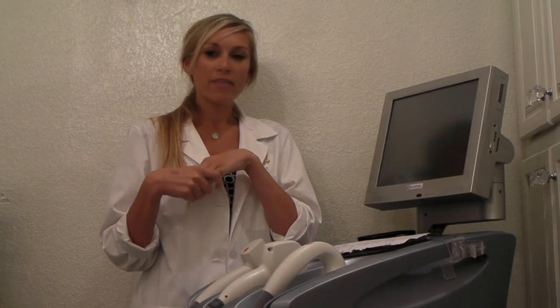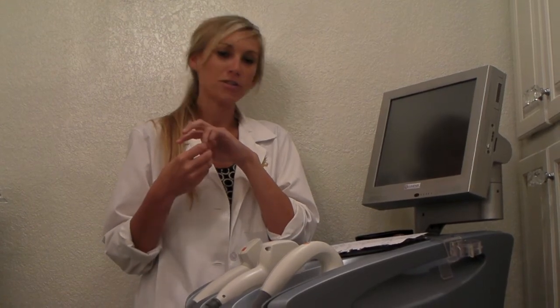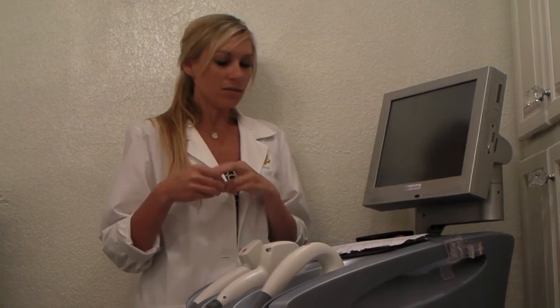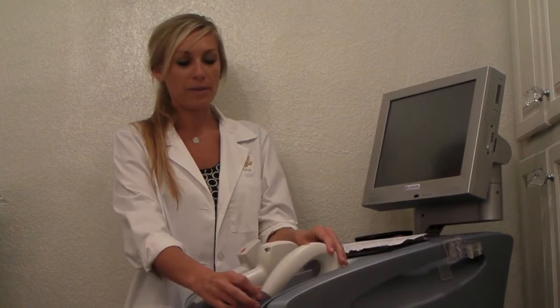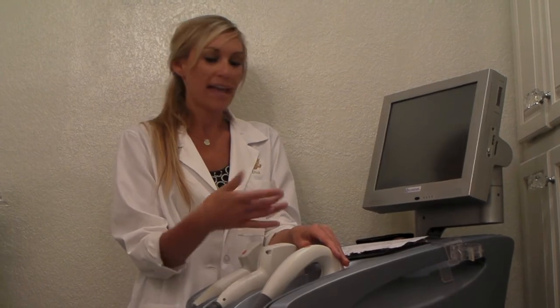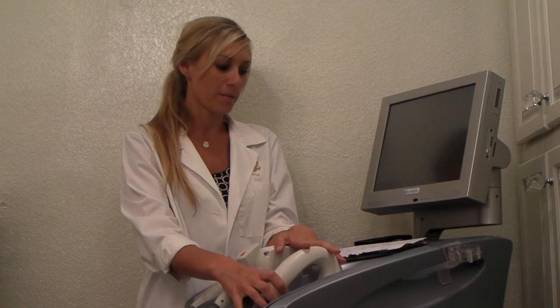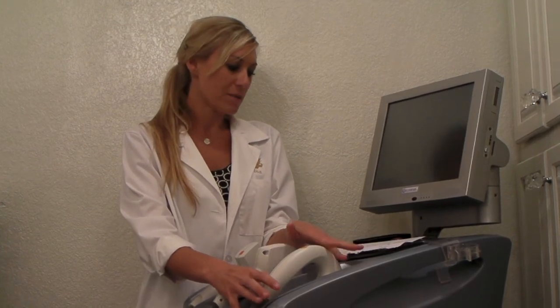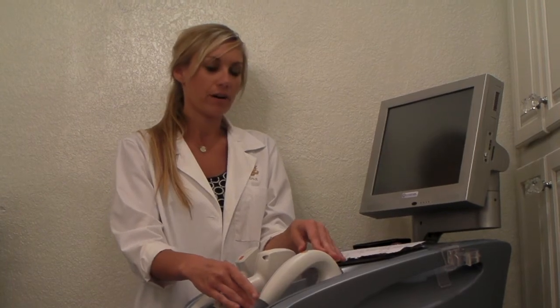Treatments are done monthly for the IPL. It's very important to moisturize during treatment, and again, sunscreen. Any of the skin lesions that you're thinking about having treated with the IPL, you should assess yourself. The ABCD rule is very important whether you're having the laser therapy or not. Watching for asymmetry, border, color, diameter changes, things like that are all very important.